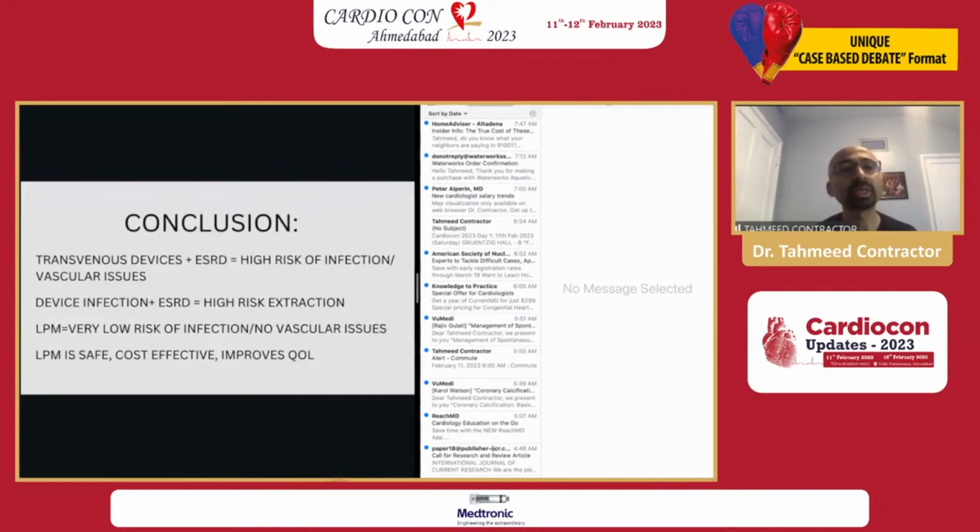So in conclusion, transvenous devices in ESRD have a very high risk of infection and vascular issues. When we have to extract devices, the risks of extraction are high, so we have to try to avoid leads in these patients if possible. Leadless pacemakers, on the other hand, have very low risk of infection, no vascular issues, and can be a safe and cost-effective strategy that can improve quality of life.